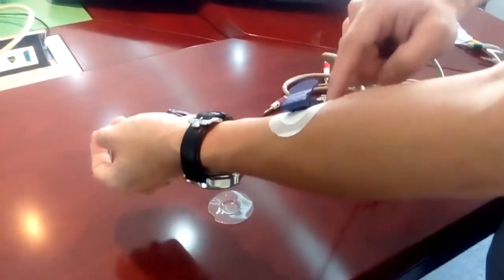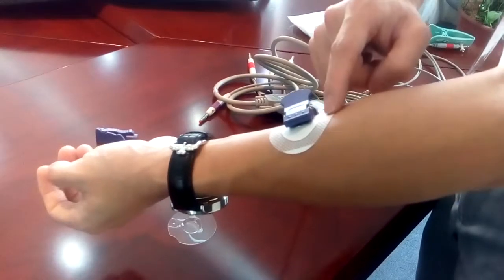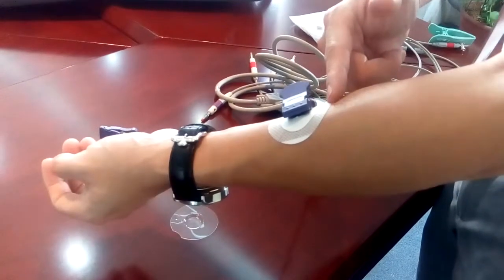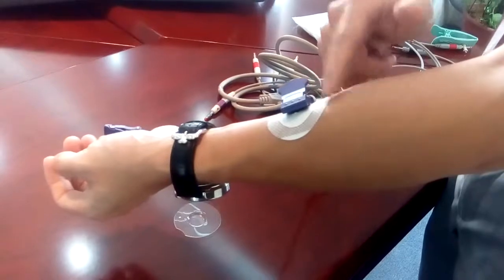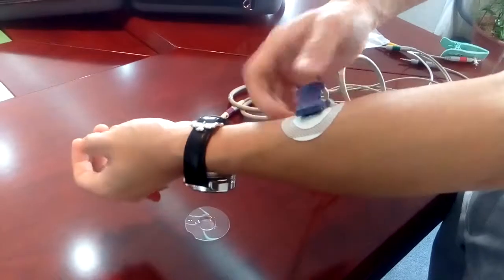This disposable electrode is for single patient use only. Usually when you do ECG for neonate, you have to choose the disposable electrode. That's why you need the adapter.